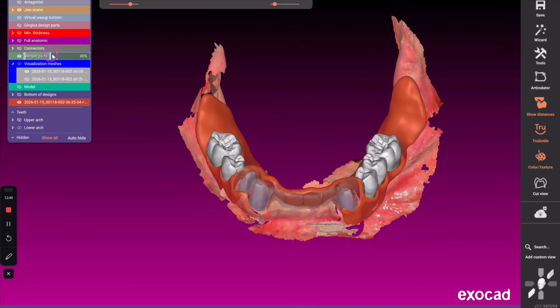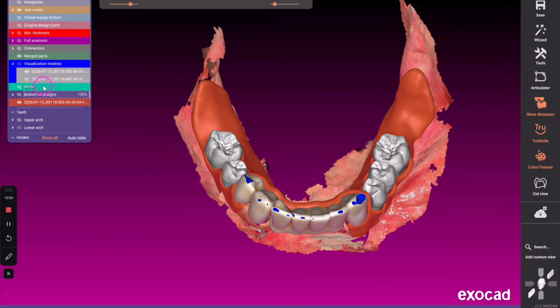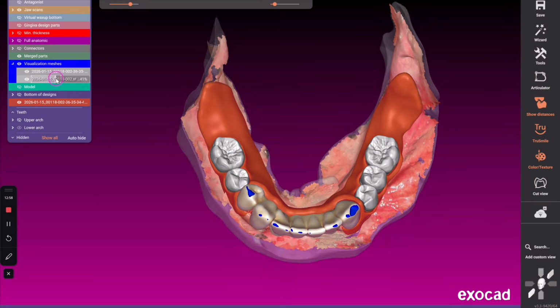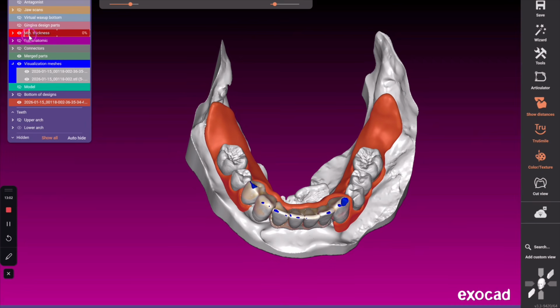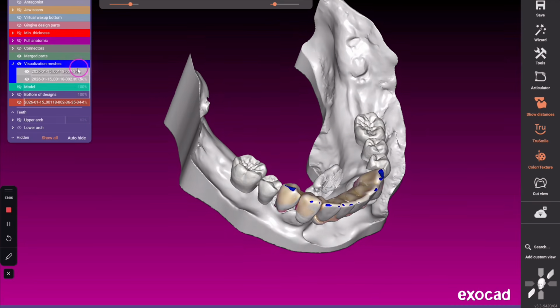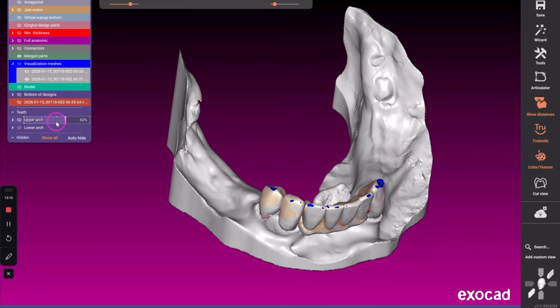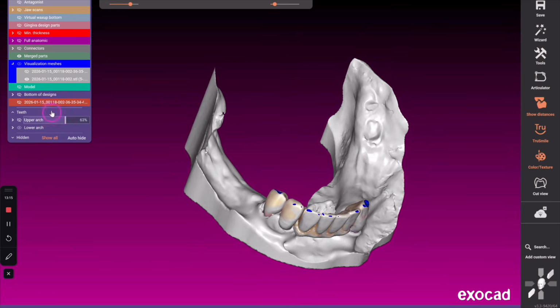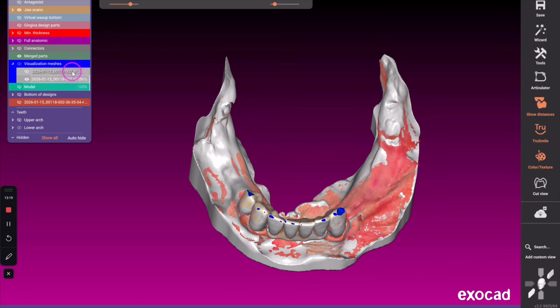Those are my preps with the path of draw from the occlusal view. And the tissue, if you look underneath, we were able to make it super cleansable. I'll show you that here in a second, hopefully. Let's see here, guys. You can look at the occlusion there against this denture. Everything's hitting equally. And I got to tell you, the delivery was like 5 seconds. Everything dropped in. No adjustments were needed to the bite, to the fit, to the clasps, to the partial. It all just went in extremely smooth.